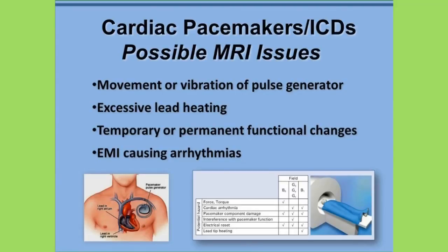In consideration of these problems, standard cardiac pacemakers and ICDs are generally considered to be strictly contraindicated for patients referred for MRI exams. However, there have been many reports of safely performing MRI procedures in patients with standard cardiac devices under highly specific conditions and with careful physiological monitoring being used, as well as with other safety policies and procedures being followed.